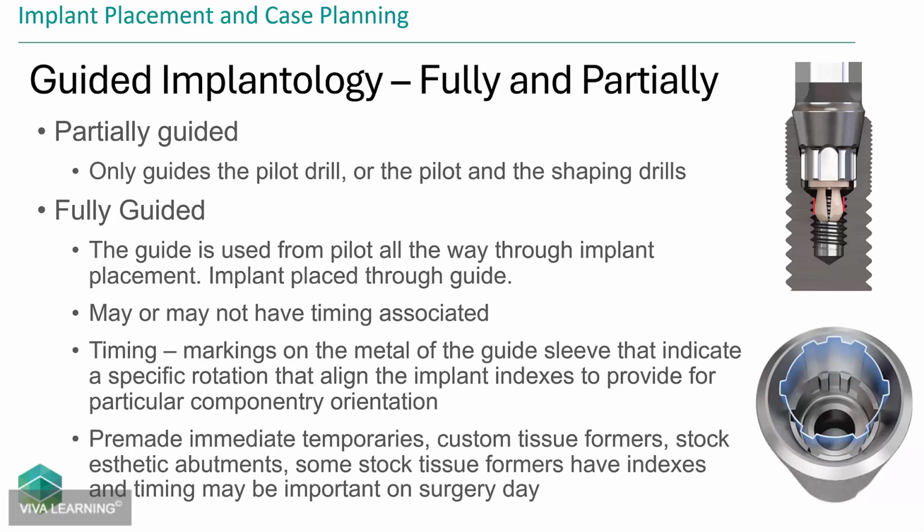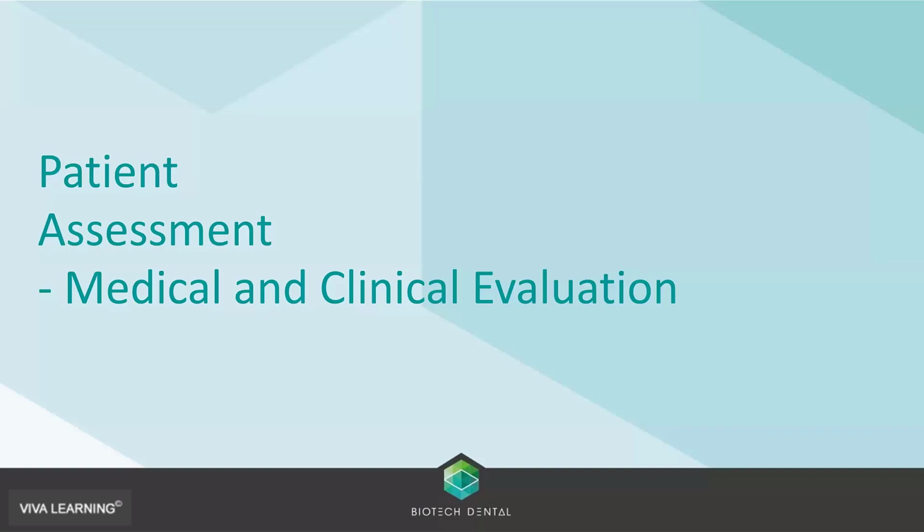And then there's fully guided, which is where you put the implant through the guide. Partially guided is where you just do a pilot. I don't see many partially guideds anymore.